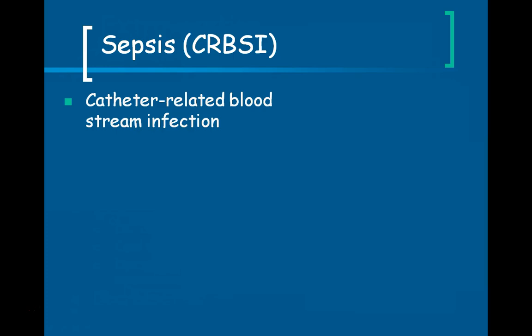If a patient gets a bloodstream infection from an IV, it's something that somebody did wrong along the way, either when the IV was started, when tubing was changed, or tubing was connected to the IV tubing like an IV piggyback, aseptic technique wasn't used, or the dressing came up, it wasn't occlusive and didn't get changed. All those things can cause an infection, but they're all avoidable.